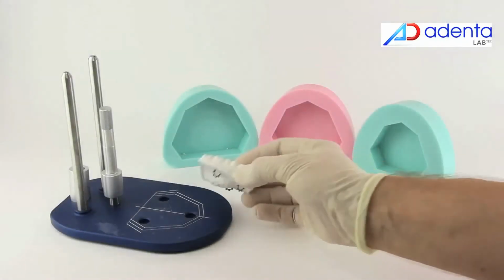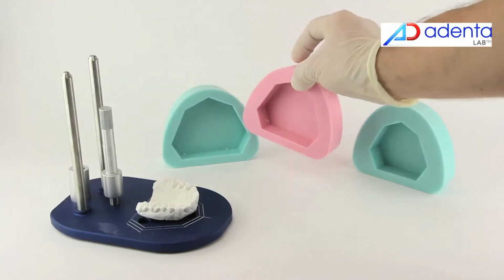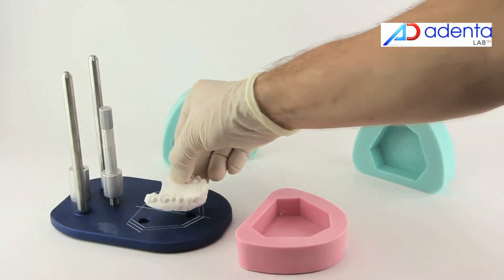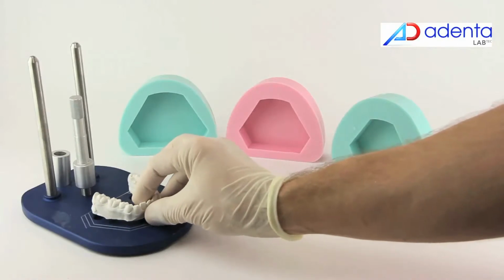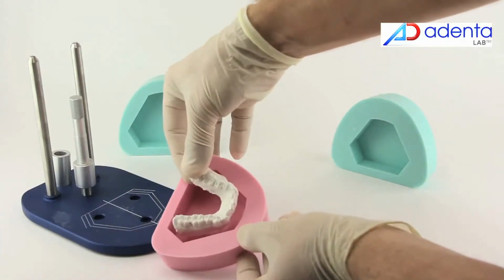Chapter 3: Upper Model Positioning. Using the measuring scheme on the system base, we can determine which silicon mold size should be used for the upper model. In this case, medium-sized silicon molds should be used. We check the size of the lower mold. In this case, the medium size should be used too.